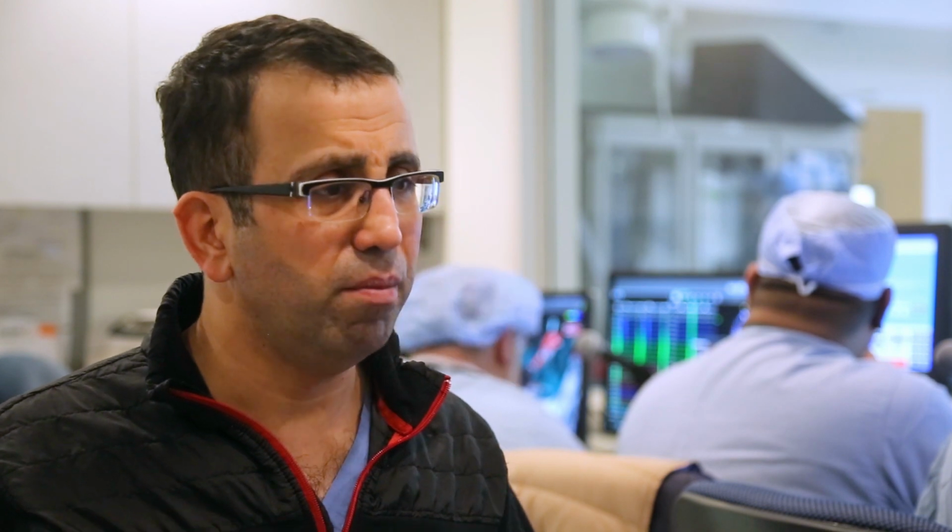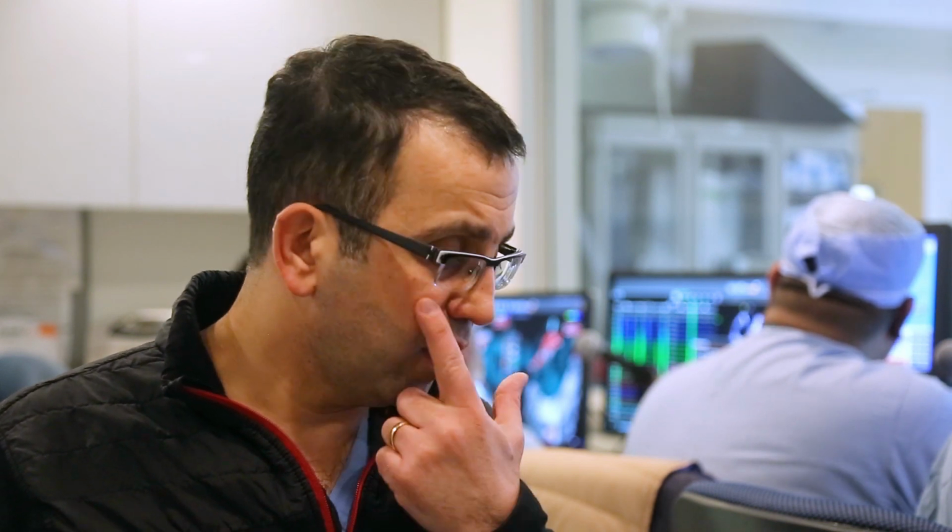So there is a role for this protocol in patients that have more than just lone AF. Patients again with sleep apnea, hypertrophic cardiomyopathy, and women. And in these patients, this protocol is a very good protocol to use, especially when the PVs are chronically isolated.